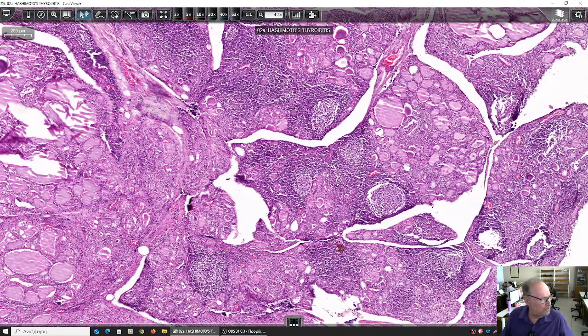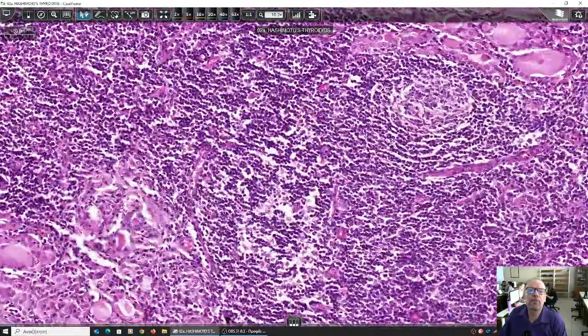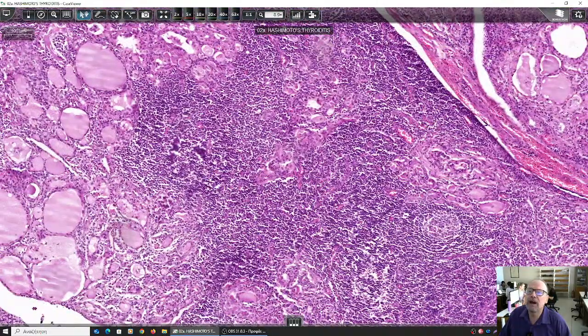So since this is an autoimmune disease, these B cells will secrete autoantibodies that will circulate, and when we count them in the blood, this will be compatible. It's not absolutely necessary for the diagnosis, but of course it's compatible. The presence of autoantibodies against thyroglobulin. The other cells are probably of which nature, so that the destruction of the follicles, you see how the follicles become shrunken?